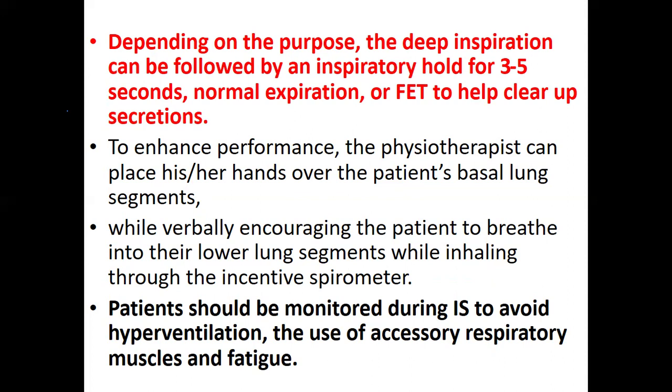It is marking their improvement, and they are able to observe how much better they are doing. Depending on the purpose, the deep inspiration can be followed by an inspiratory hold for about 3 to 5 seconds, then normal expiration.